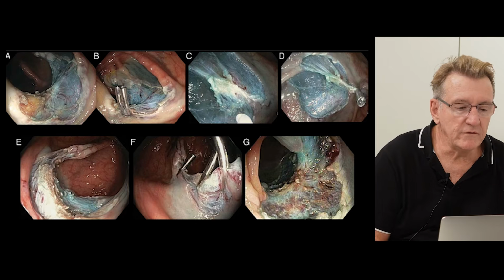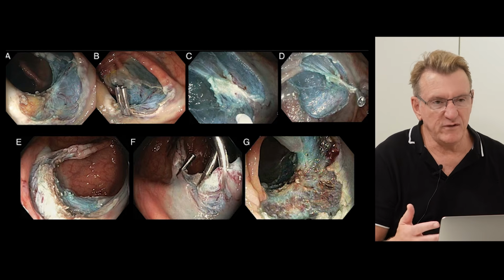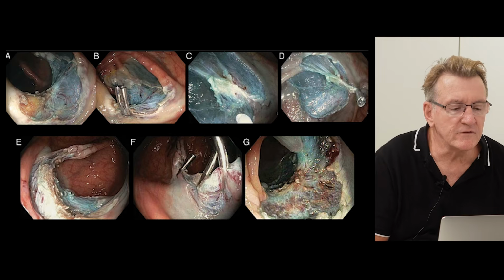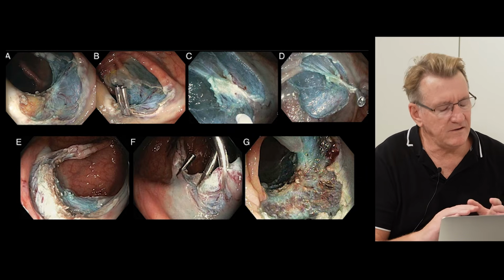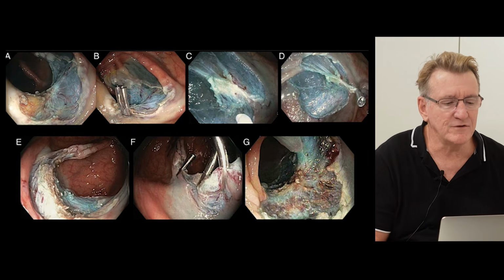So type 2, is it dangerous? How does it look like? Here's a good example. So type 2, just contrast type 0, type 1 with type 2. So this is a typical type 2. You can't tell, we don't know if we've injured the muscle there. It's really a charred mess because of the fibrosis. I think this was a scarred polyp overlying an anastomosis. And under those circumstances, and in this day and age, it's acceptable to be very aggressive and, in an expert centre, you needn't worry about making a hole. You don't want to, but if you do, you've just got to recognise it.